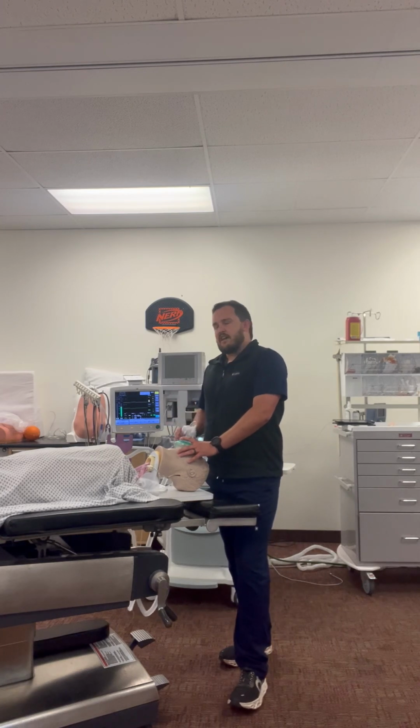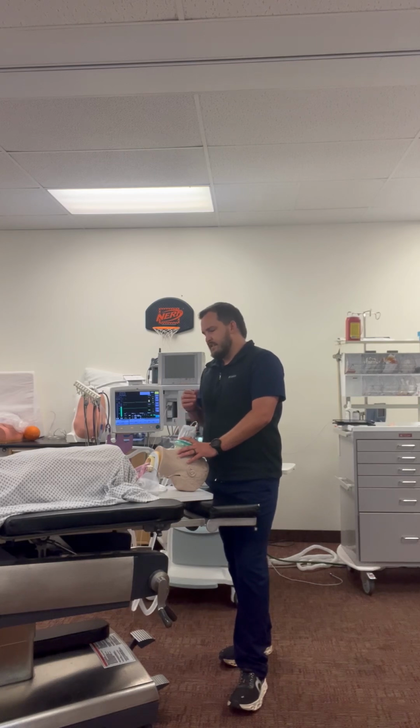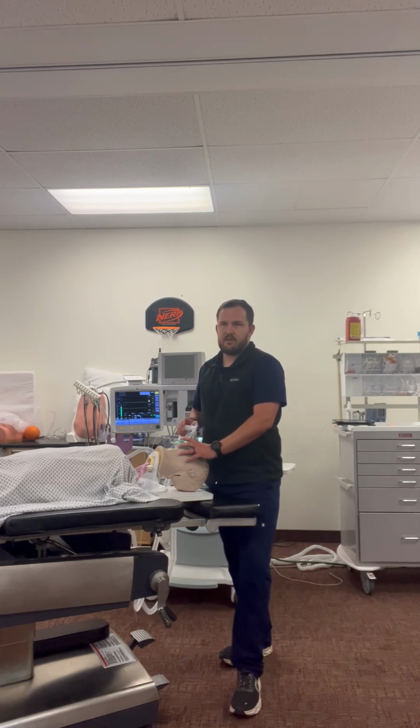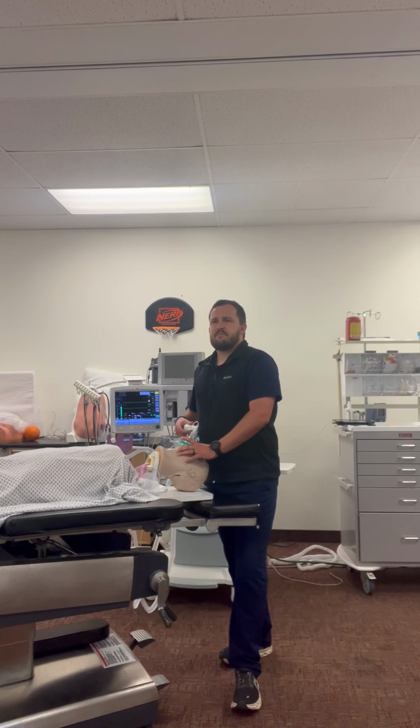Now, risks that could happen during this time is bronchospasm. A risk is asthma or any type of pulmonary irritation, which this patient doesn't have, but signs of that would be wheezing and high airway pressures. Treatment's 100% oxygen, manual ventilation to assess how severe. I can then deepen the sedation with sevoflurane, administer beta-2 agonists such as epinephrine or albuterol, and kind of just treat it that way and wait it out.